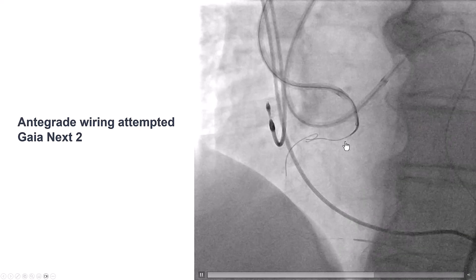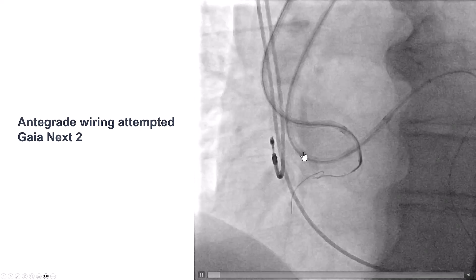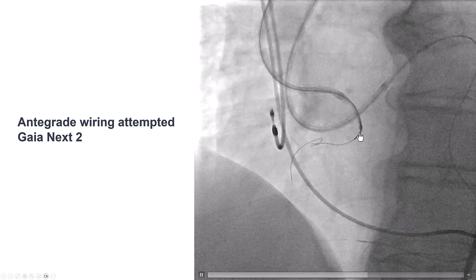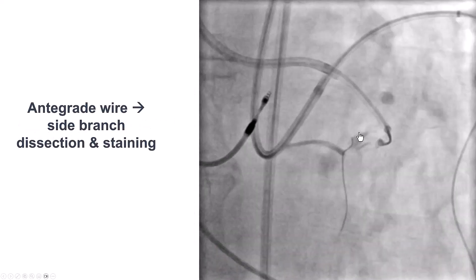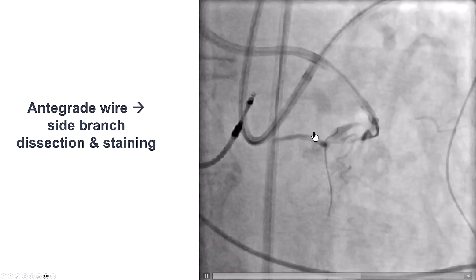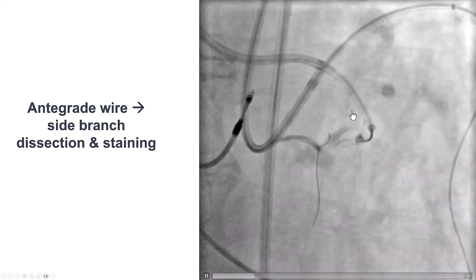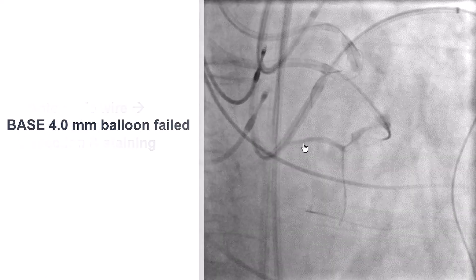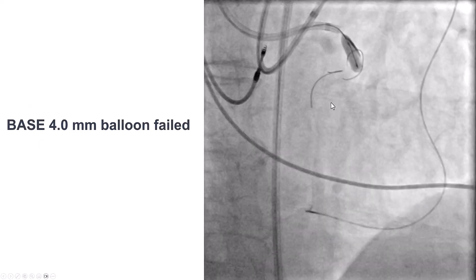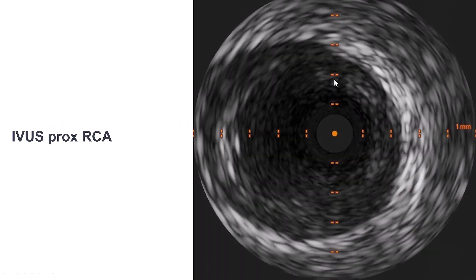We then decided to try some antegrade crossing attempts to make the reverse CART, using a Gaia Next 2 wire. However, the wire kept ending in a small branch. We did have some retrograde dissection, but were unable to make the antegrade wire go into the extraplaque space. We therefore decided to use the BASE technique — balloon-assisted subintimal entry — using a large 4.0 mm balloon with an antegrade microcatheter next to it, trying to push and create a dissection and a loop into the extraplaque space antegrade.